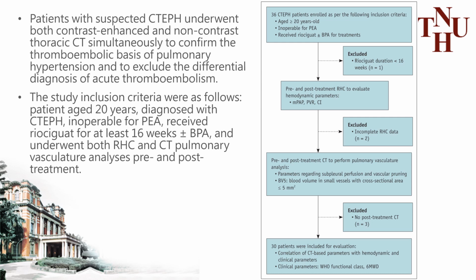A total of 30 patients have the complete data, and the correlation of CT-based and right heart catheter-based hemodynamic parameters were analyzed. In addition, clinical parameters such as WHO functional class and 6-minute walk distance were also analyzed.